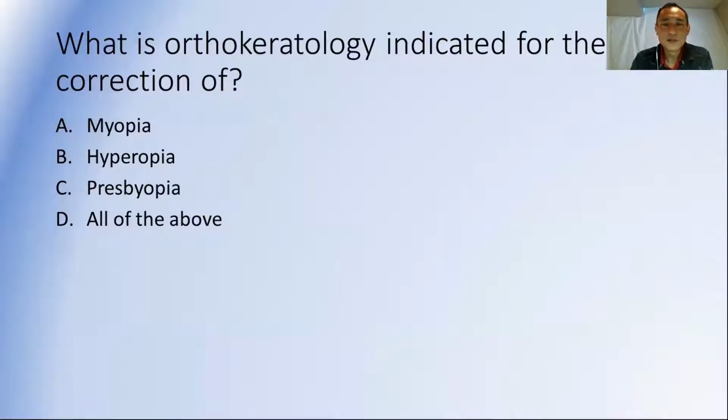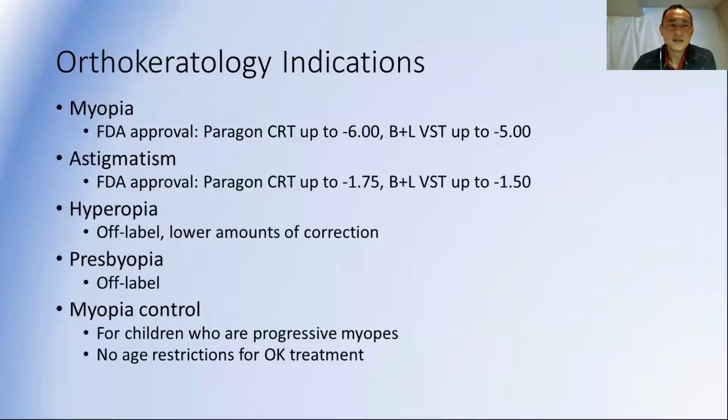Okay, so most people said that it's indicated for the correction of myopia. A few people said hyperopia, and a lot of people also said all of the above. And the answer depends on what your definition of indication is.